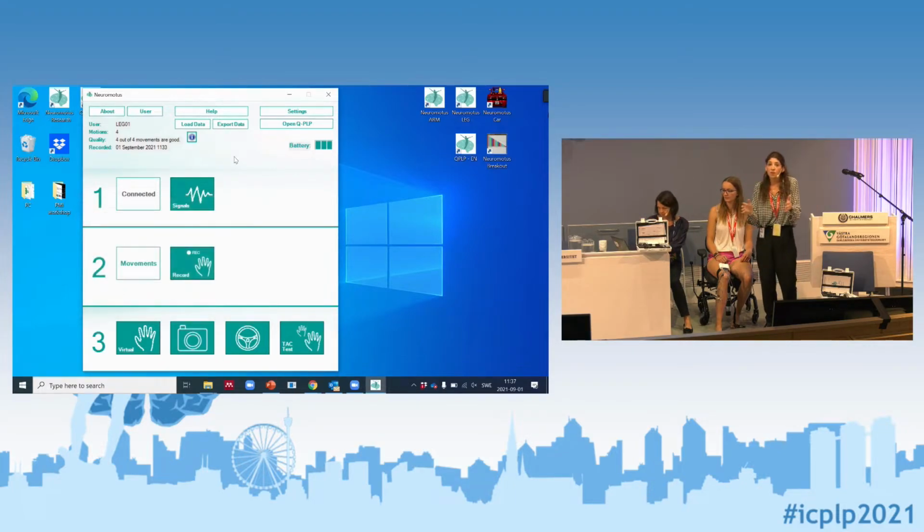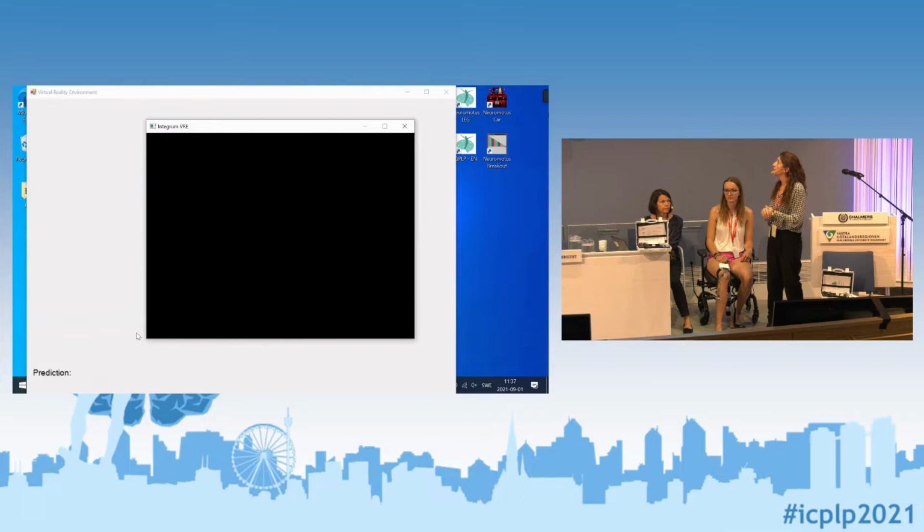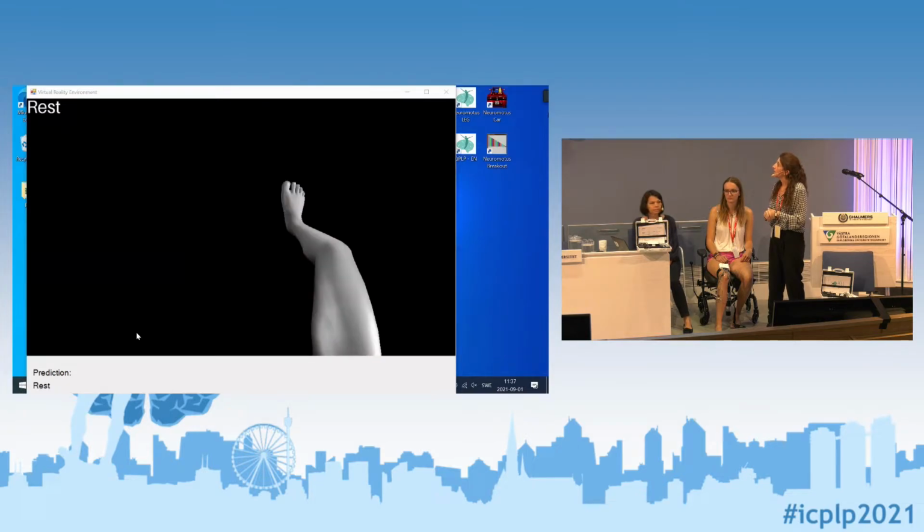Thanks. So once we are happy with our recording, we can go to the next step, and it's something that I will show you here. This is called the virtual reality step, and the idea here is that the participant can control the virtual limb in real time. So Mirka, can I ask you to do up first?